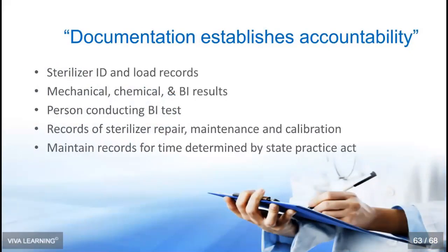If you didn't write it down, it didn't happen. And so, if you're using a mail-in service, obviously part of a mail-in service does the documentation for you. If you're using in-office, that's totally acceptable by the CDC as well, but you need to make sure that you're writing everything down. Make sure that you're writing it down in pen, not in pencil. If there's an error, just make a single strike through. Date it and initial that strike through so there's no confusion as to what was being written.